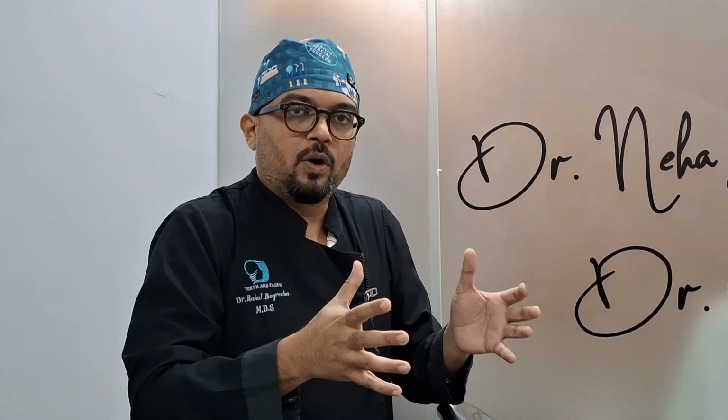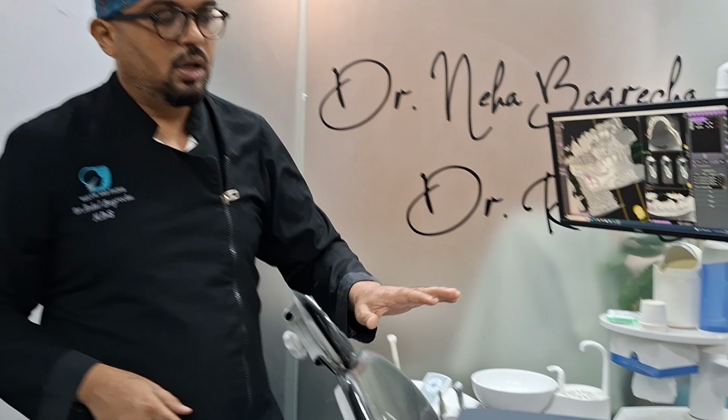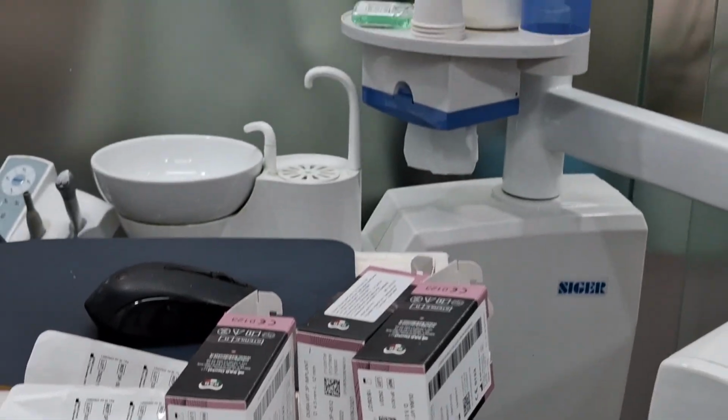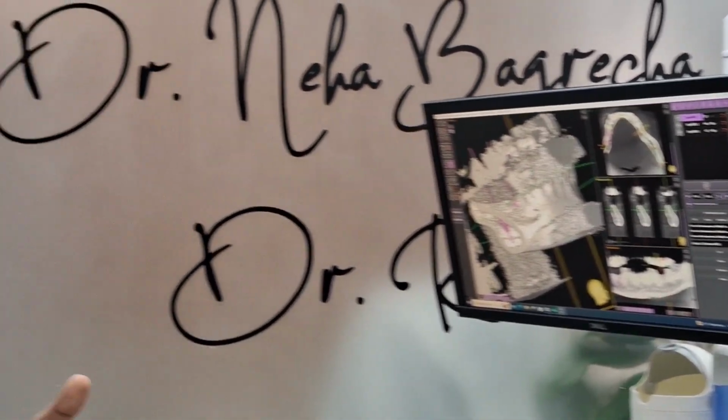That is why a broader implant means lesser cantilever, lesser forces. That is why we wanted to put a broader implant, and we could put a broader implant. We have placed three implants with grafting, and we've just finished the case. We've just given a prescription to the patient, seen the patient off, and are making this video for you.